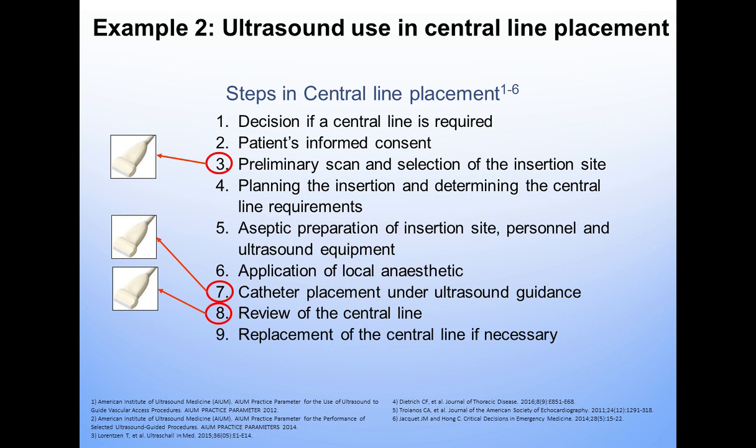But then the insertion is planned and the location is selected, and then the skin asepsis occurs. At that point, that probe then needs to be minimally high-level disinfected or preferably sterilized, and then it can be used to guide the placement of that catheter. And we'll get to why this is so important on the next slide.